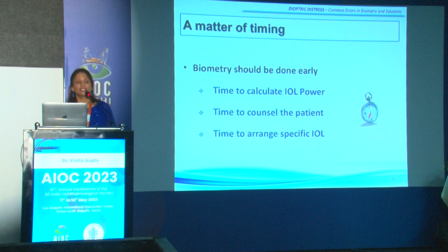When should you do it? It is a matter of great timing as well. You should have ample time to calculate the IOL power, time to counsel the patient if there are odd powers, or what type of refractive error does he want? Does he want emmetropia? Because emmetropia may not be the target always.